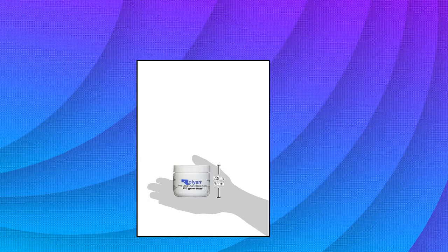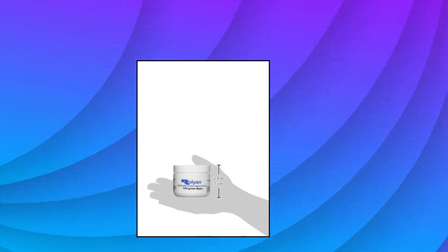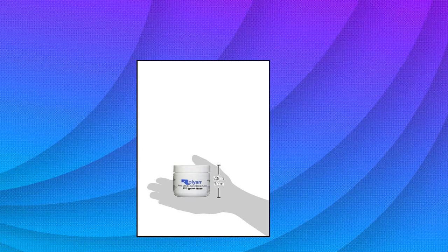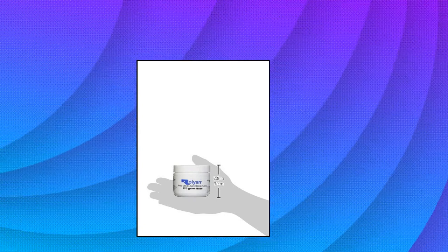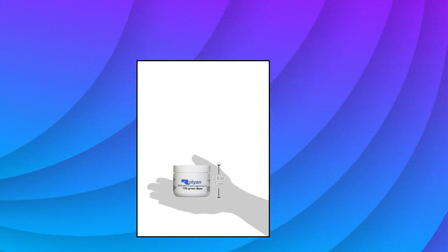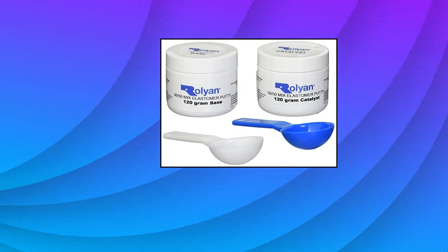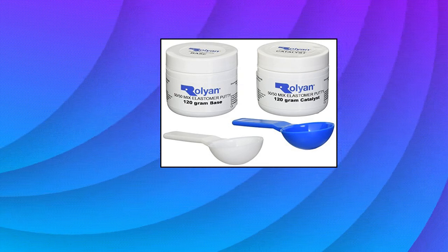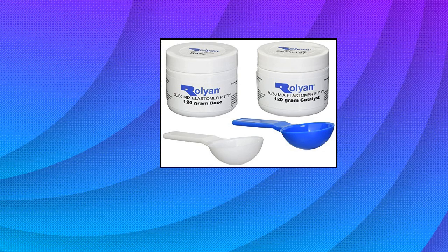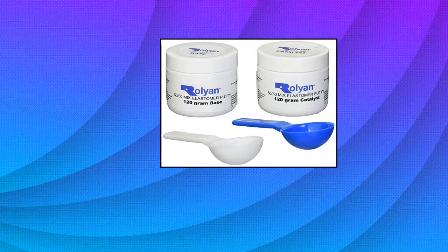Rolion 5050 Mix Elastomer Putty, 8.47 ounces, pliable occupational therapy putty for hand therapy splints. Pliable elastomer putty can be added to splints, gloves, or braces to add pressure to scar tissue and break up scarring. Can also be used to form a built-up handle on eating utensils and other tools to make them easier to grasp for those with limited grip or hand function. 8.47 ounce tub, 240 grams, of pliable putty for use in physical therapy and occupational therapy settings.